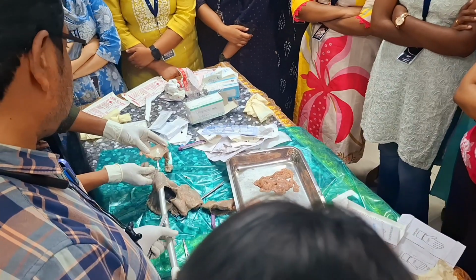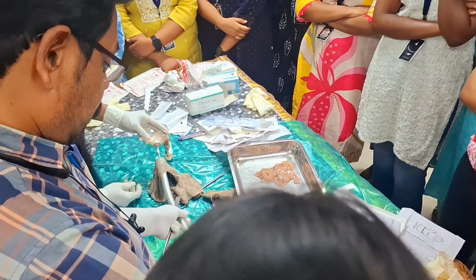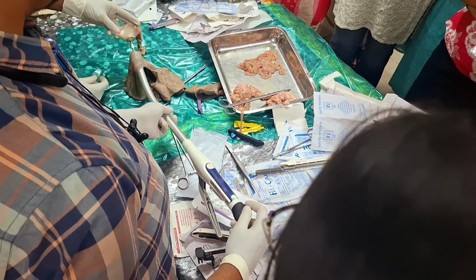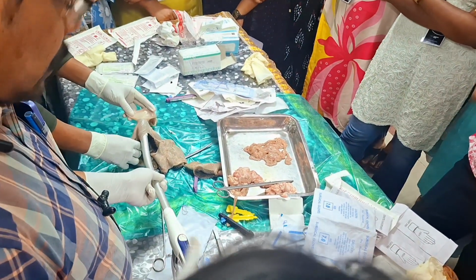Get a sense? Now you take the safety out. While you keep on rotating that, see both ends are coming together. You got a click there.